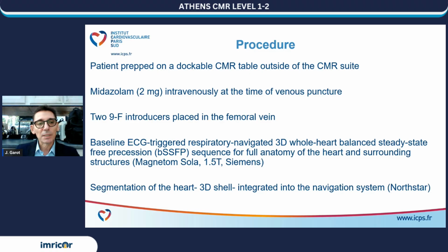For the procedure itself, the patient is prepped on a dockable CMR table just outside of the CMR suite. Midazolam is injected intravenously at the time of venous puncture, and the venous puncture is made outside of the MR suite under echo guidance. Then two 9F introducers are placed in the femoral vein.